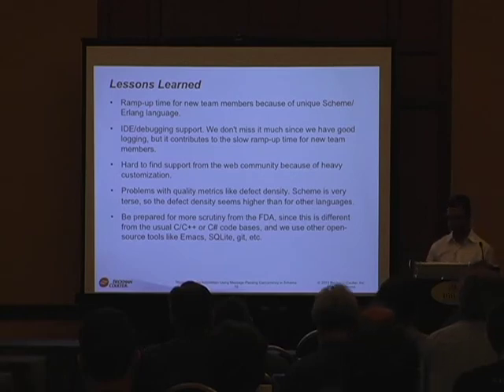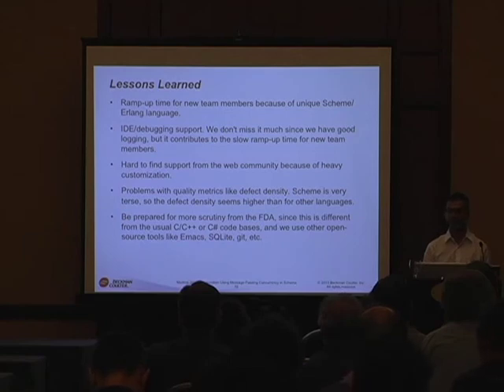And then the FDA is scared about new technology like this, which they haven't seen before. You're using all of this open source stuff. We don't know where it came from. How do you know this is good? How do you know this is bad? And rightly so, because they don't, and we can't give them a good explanation. So the onus is on us to say, hey, this is good stuff, and one way to do that is to actually write good documentation when we are writing this software. That is important to do.